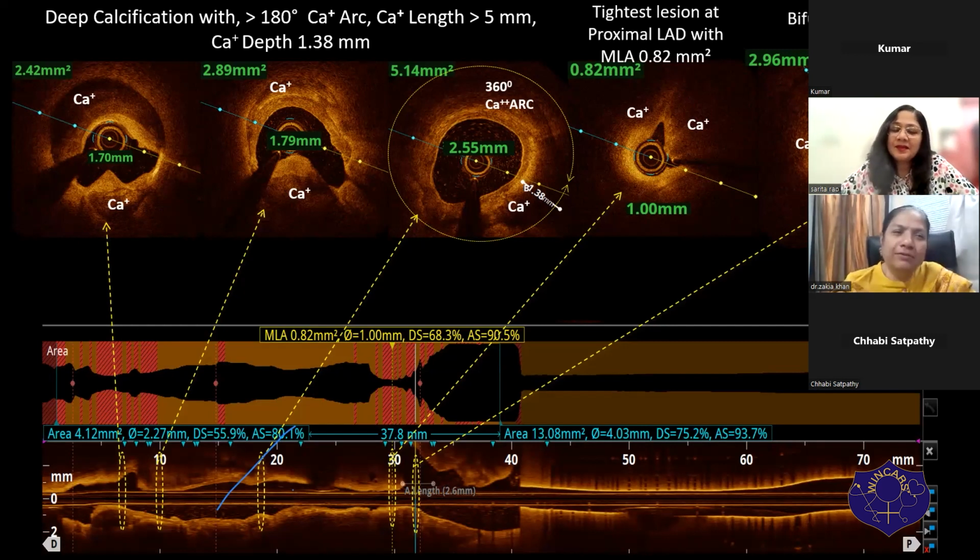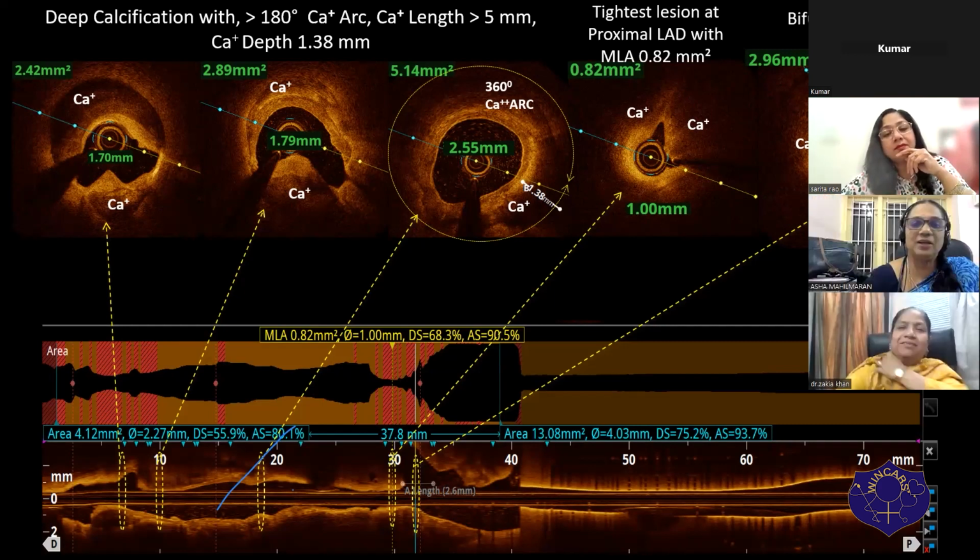I don't know. Sarita, I would have even maybe put a cutting balloon first, and see how much a cutting balloon helps me. If a cutting balloon helps me, then maybe go in with the IVL. Sarita, I joined late, but extraordinarily good images, excellent demonstration of the OCT images. I really love these images and beautifully demonstrated calcium nodules.